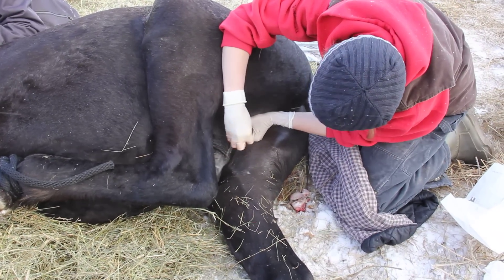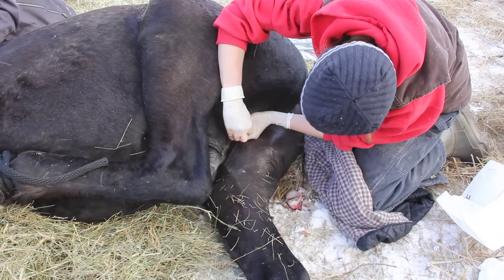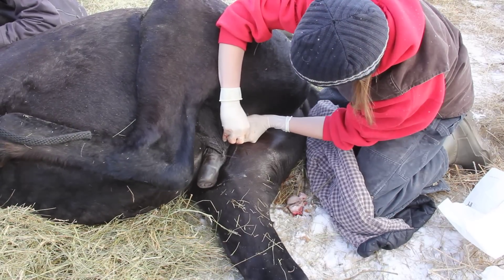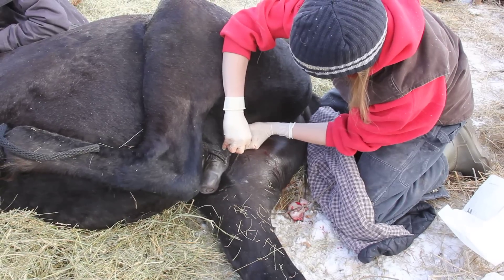Alright, let's do the big one now. The big one that looks even bigger with freezing in it. Oh! That's just testicle.